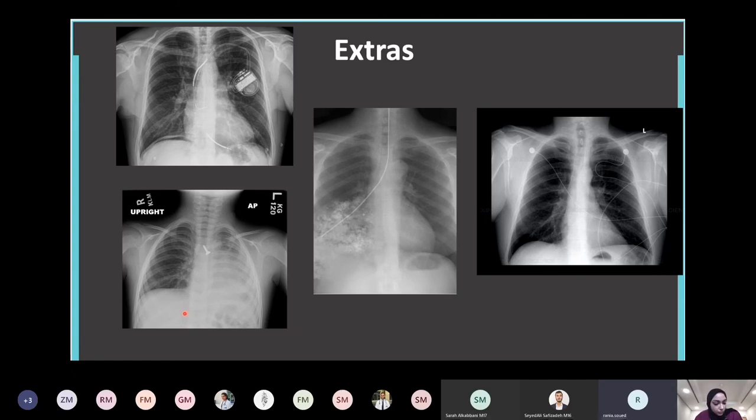So if I call my doctor and ask him, what did you do? Where exactly did you go? It's not like he just had an operation the day before. I need to know where exactly he went to know what is the risk of it being a perforation versus being just a normal thing after laparoscopy.